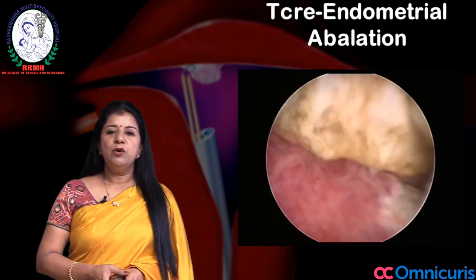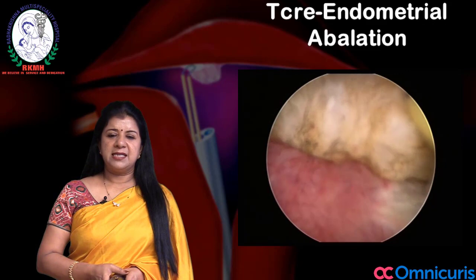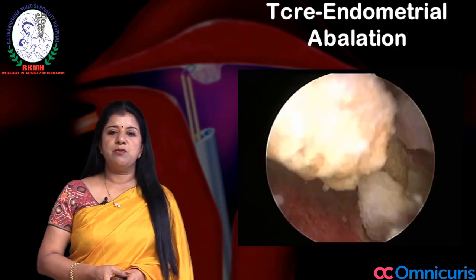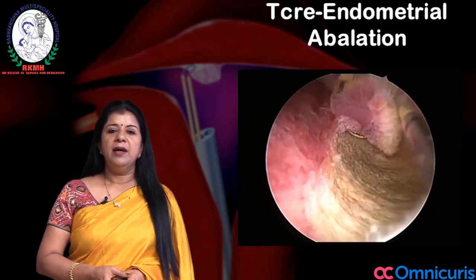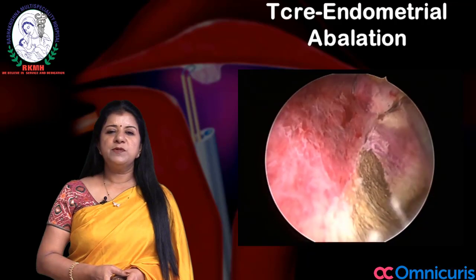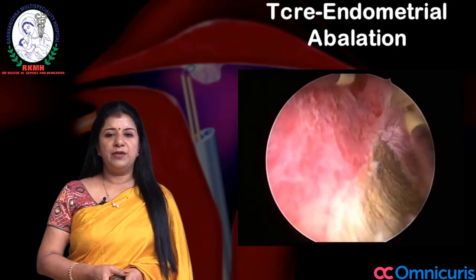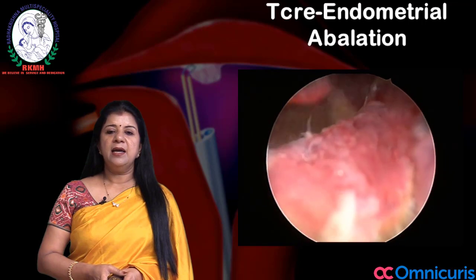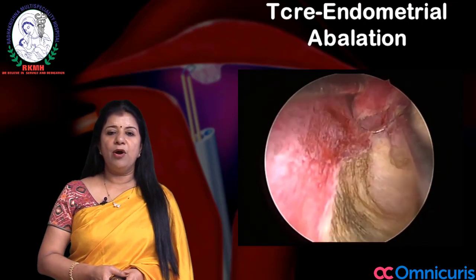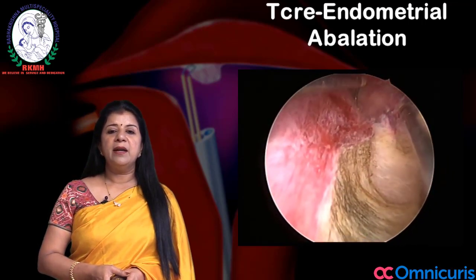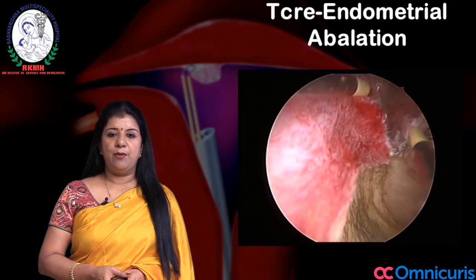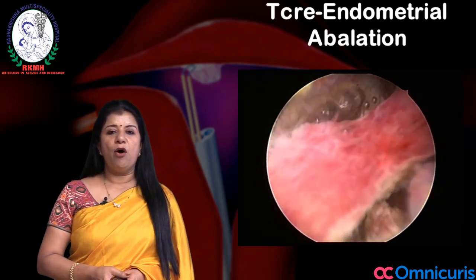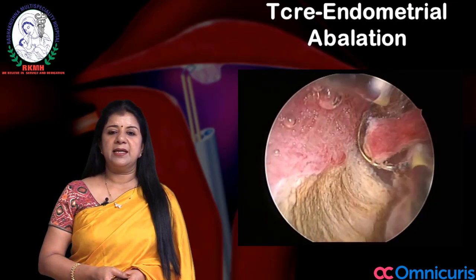Now you take a loop endometrial resection and then you take loops from the posterior wall. Here you can see these are the loops taken from the posterior wall of the uterus. There is a pattern in doing TCRE — you start from the posterior wall and remove all the bits from the posterior wall. You can go from middle to side or from one side left to right.